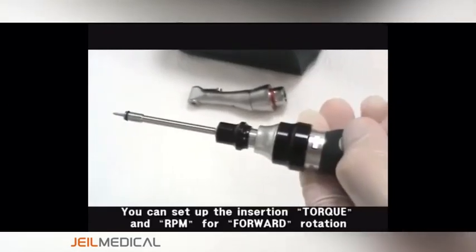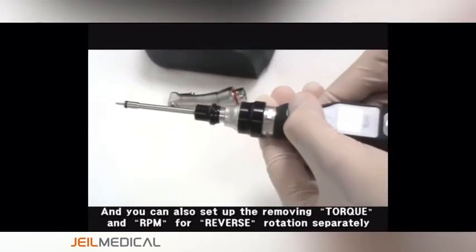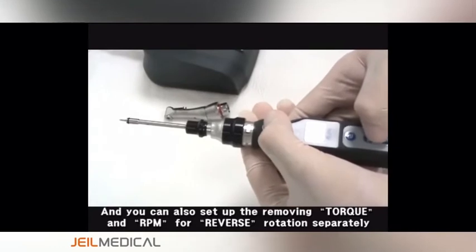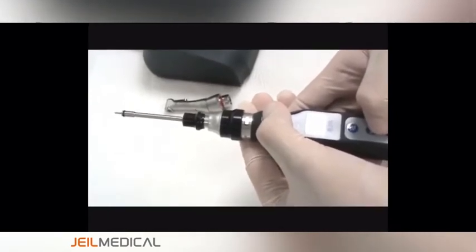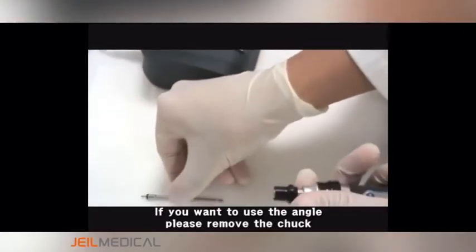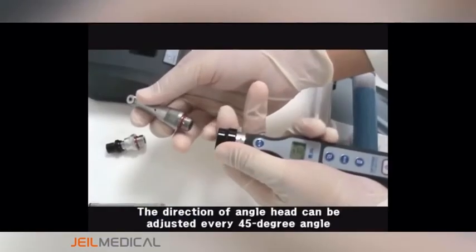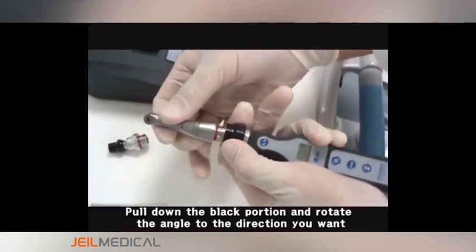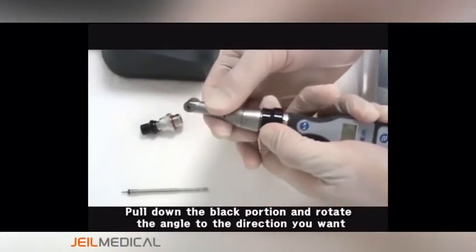You can set up the insertion torque and RPM for forward rotation. If you want to use the angle, please remove the chuck. The direction of the angle head can be adjusted every 45 degrees. Pull down the black portion and rotate the angle to the direction you want.